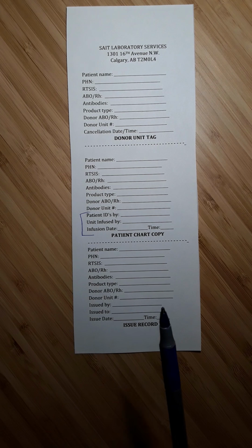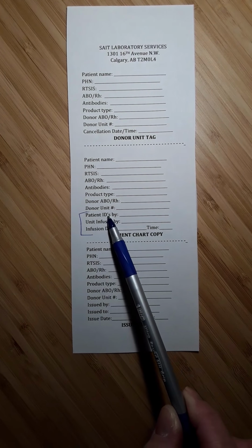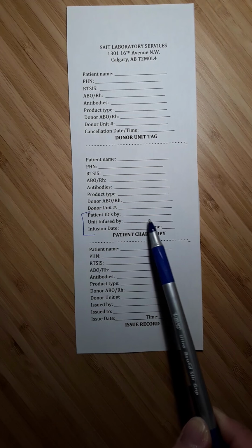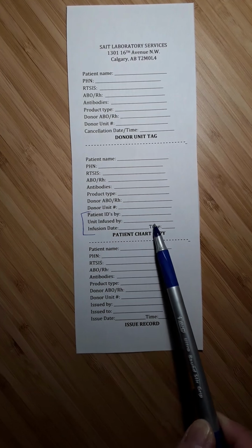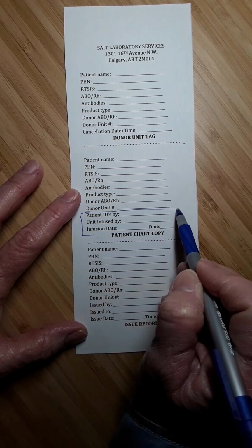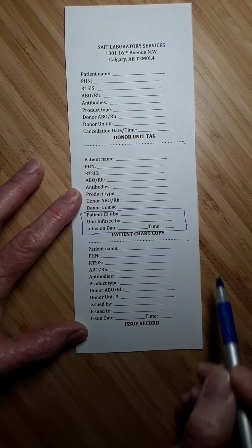When that is done, though, the patient will be ID'd by someone, the unit will be infused by someone, and they will note the date and time. So this section of the tag is not filled out by us, the MLT.